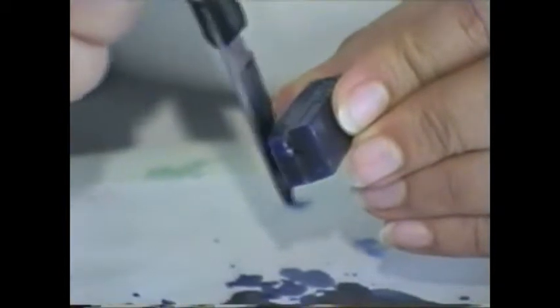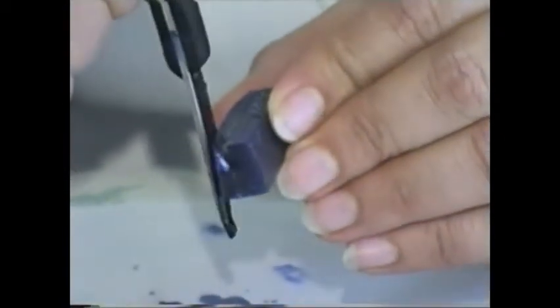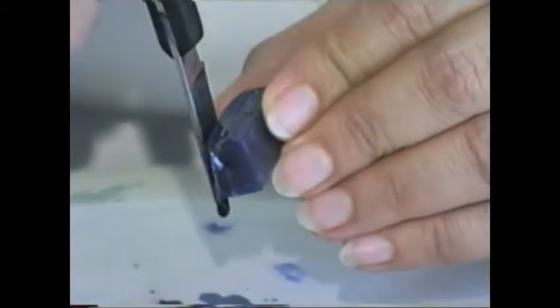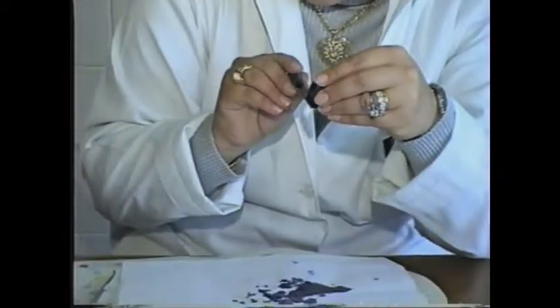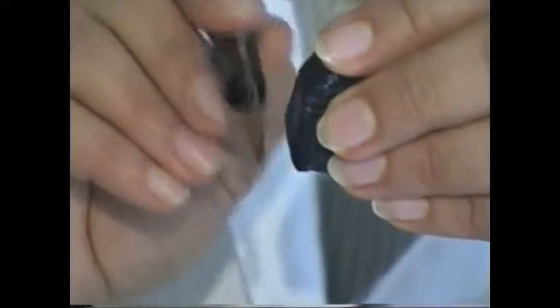Then you are going to remove the millimeter with the carver, like this. Round up the apex. Round up the apex, like this.